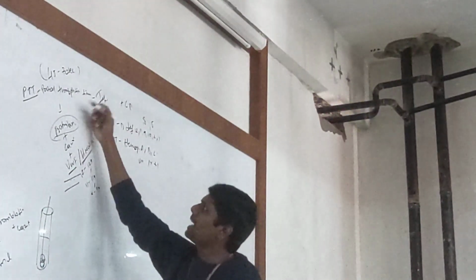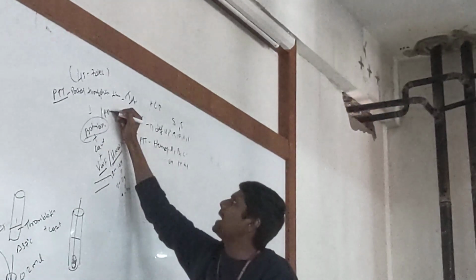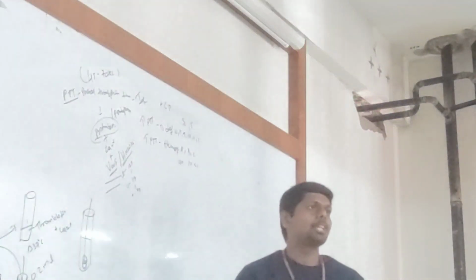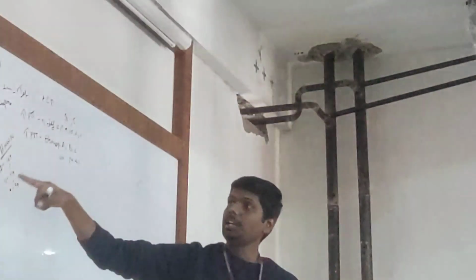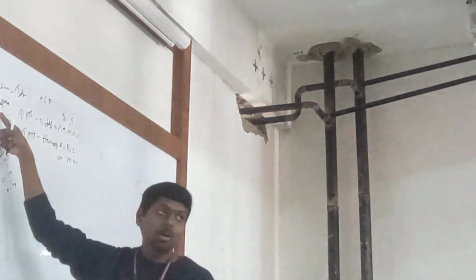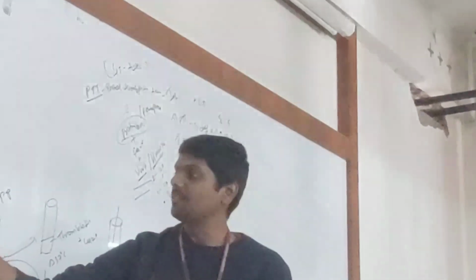Okay, partial thromboplastin actually. This is not prothrombin. The reagent is partial thromboplastin, which will be added, and partial thromboplastin will act as an activator for this intrinsic pathway. So the intrinsic pathway will be initiated by partial thromboplastin, whereas thromboplastin will activate the extrinsic pathway. Keep in mind.